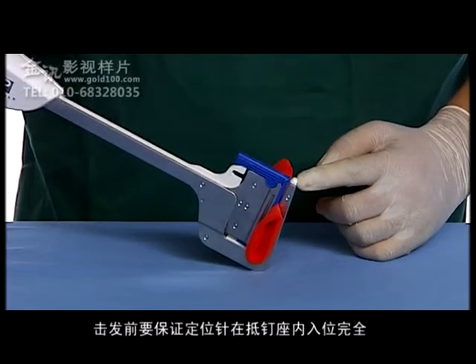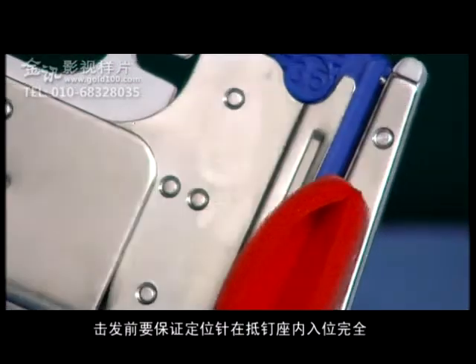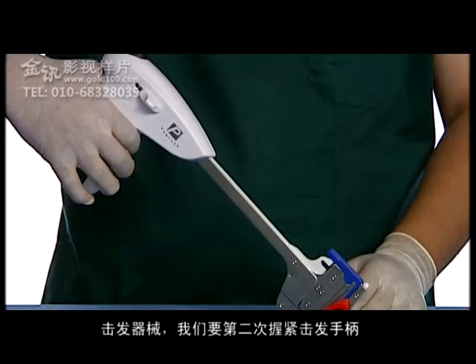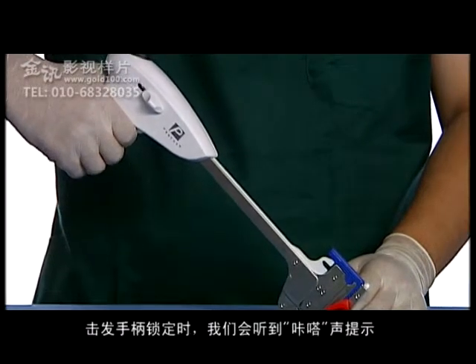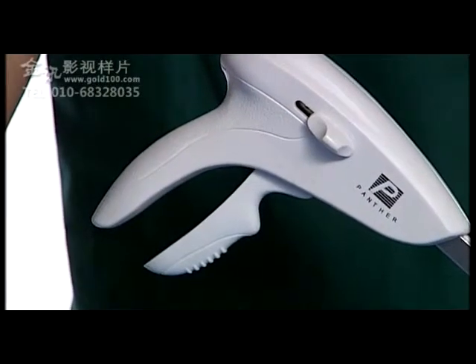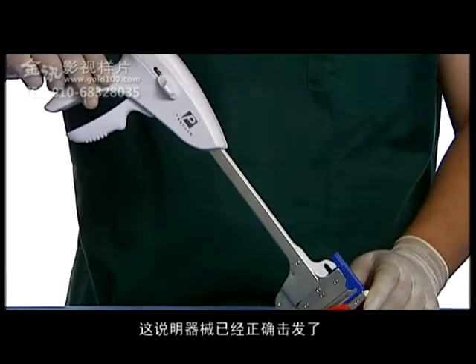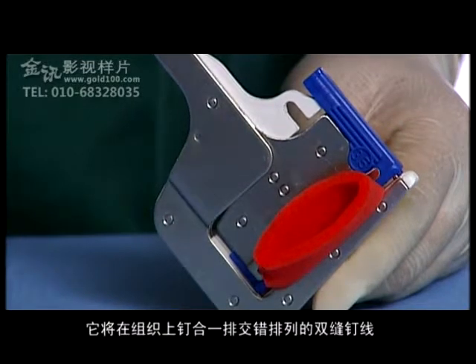Before firing, ensure that the retaining pin is fully seated in the anvil. To fire the instrument, squeeze the handle a second time until it reaches a solid stop and locks at the back position. An audible click will be heard as the handle locks. Slowly release your fingers from the handle. If it remains in a locked position, the instrument has been correctly fired. As the stapler is fired, it places 1 double staggered row of titanium staples.